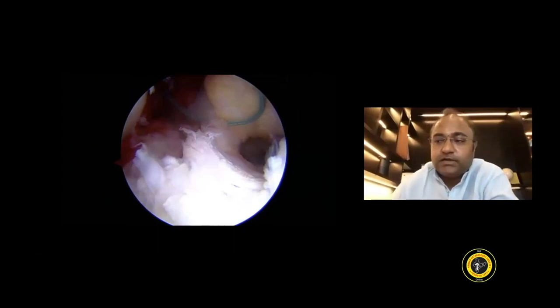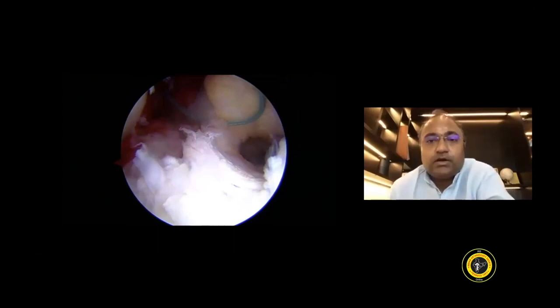The purpose of the study was to give you the tips and tricks which you need to have for dealing with all varieties of ramp lesion repairs. And if you're familiar with these three techniques, then you can manage most of these complicated lesions.